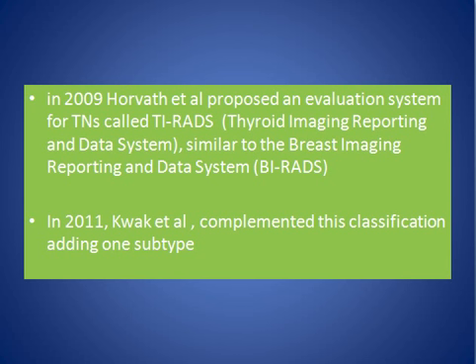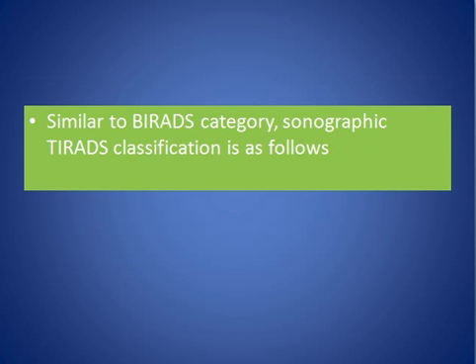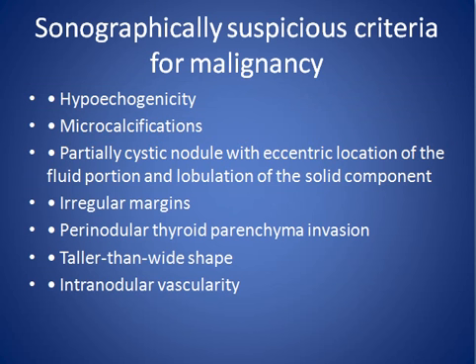In 2011, this classification was complemented by adding one of the subtypes. Similar to the BIRADS category, the sonographic TIRADS classification is as follows.